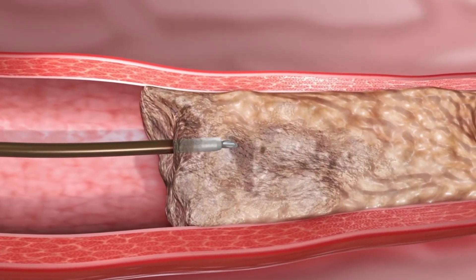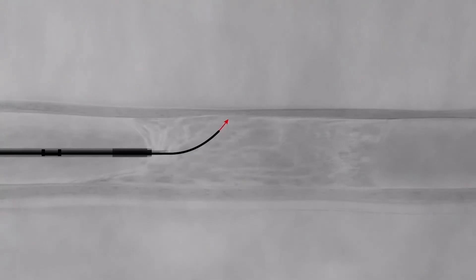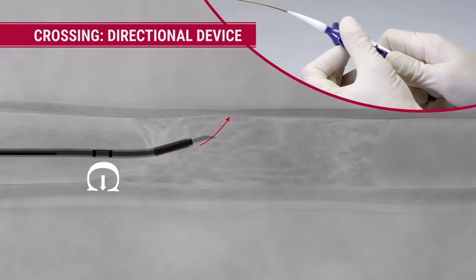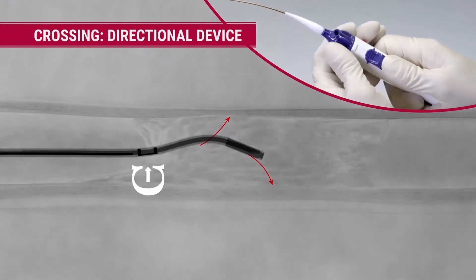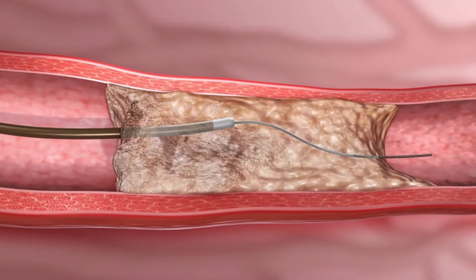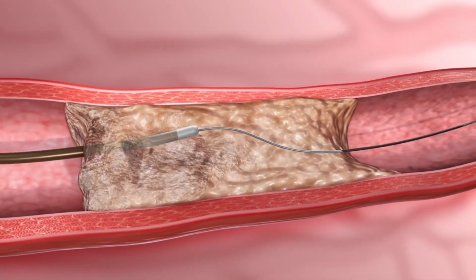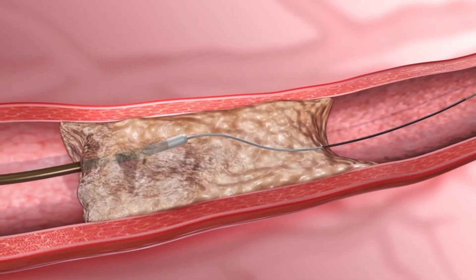Within an occlusion, the B-back is capable of redirecting a guide wire. If the wire is tracking in the wrong direction, the curved needle can be extended further, allowing the B-back to be used as a directional device. The radial orientation of the needle can be changed by rotating the B-back catheter, creating a new channel within the CTO for the guide wire to track. With this technique, the guide wire can be steered and maneuvered through the plaque while remaining in the true lumen.